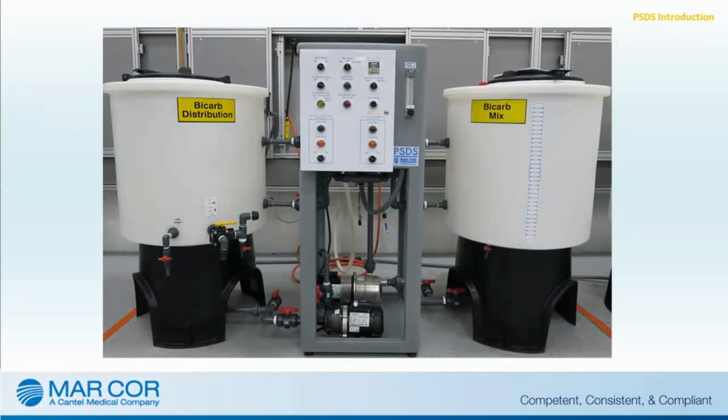PSDS provides a semi-automatic mixing of a bicarbonate concentrate powder with water that meets AAMI hemodialysis water quality standards and distributes this solution to the hemodialysis patient stations. The PSDS mix mode provides semi-automatic mixing of bicarb concentrate using a mix pump in a separate 100-gallon mix tank. Once the bicarb solution is mixed and verified to the concentrate manufacturer's specifications, the PSDS can be placed into a transfer mode of operation, and the solution is pumped to the 100-gallon distribution tank.